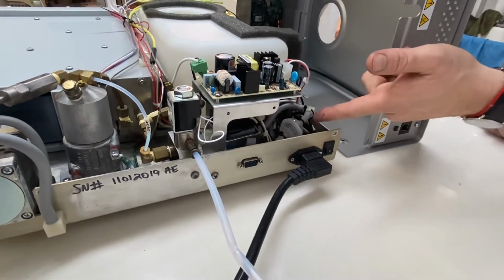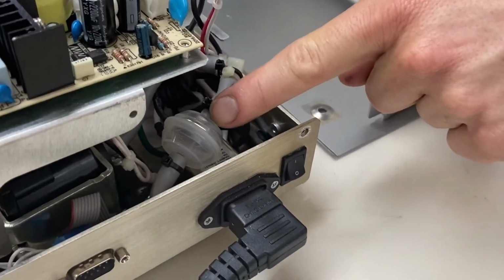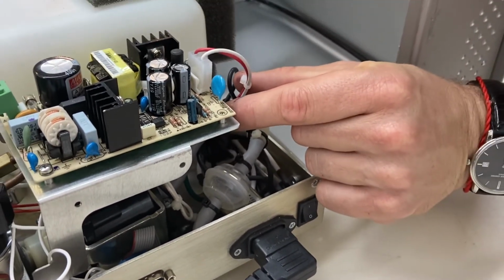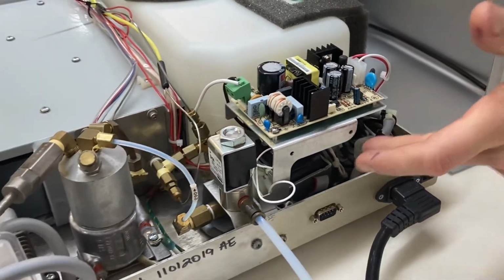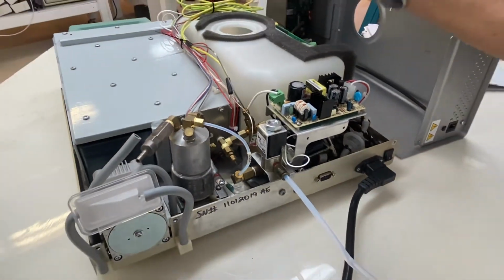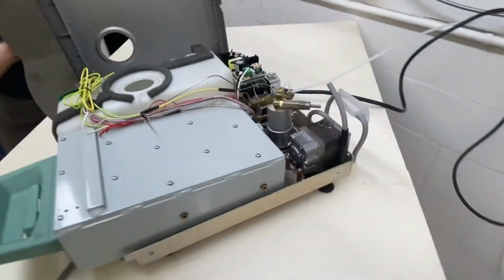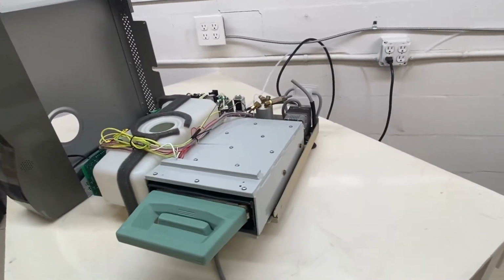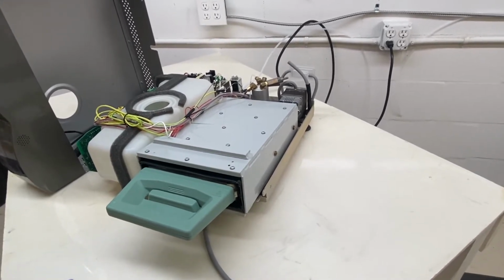It's real easy. Next, you're also going to want to pay attention to this float. You're going to want to make sure water's in the float. Also, sometimes they're set up where the float is way up here, and that would also allow the pump to lose prime, which, if you fill the water reservoir with water, may solve that problem. Either way, we'd love to help you. 704-966-1650.